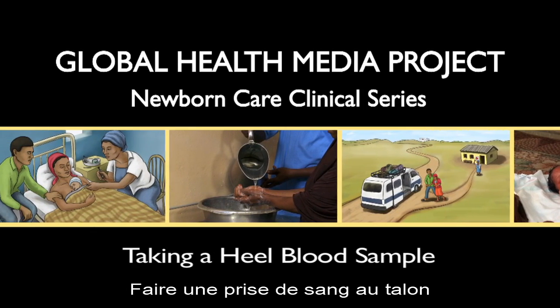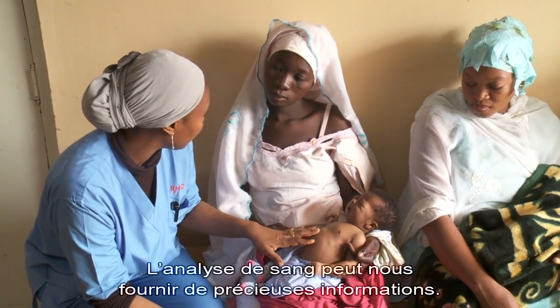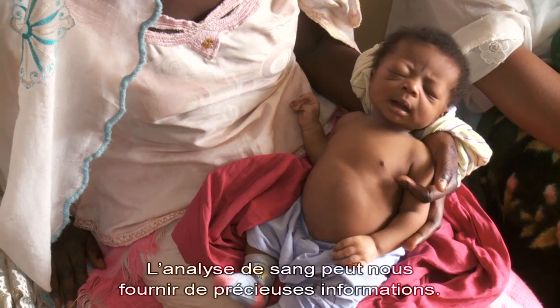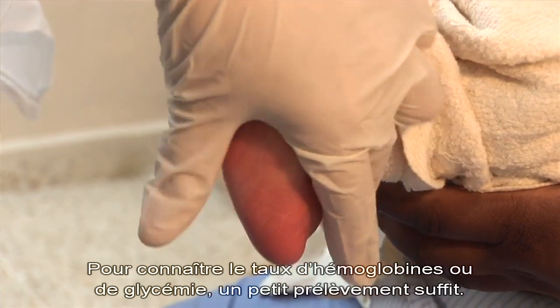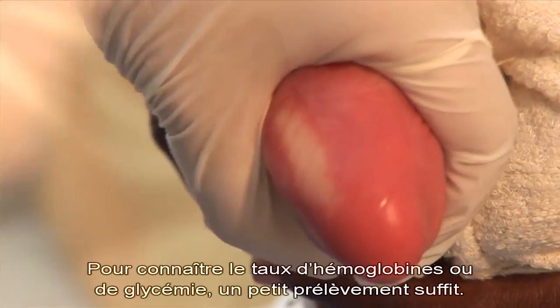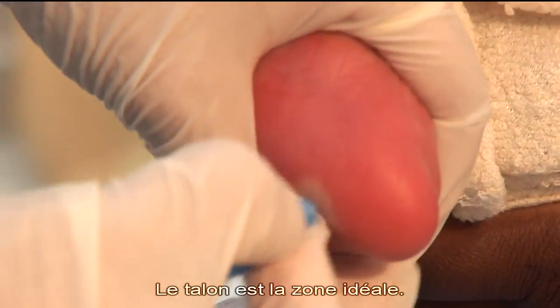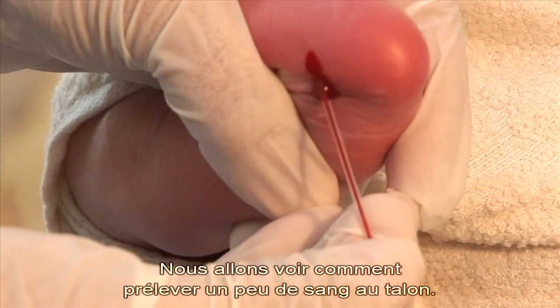Taking a Heel Blood Sample. Lab tests can give us valuable information to help a sick baby. Some tests, such as hemoglobin or blood sugar, only need a small amount of blood. A heel sample is best for that. This video will show you how to take a small sample from the heel.